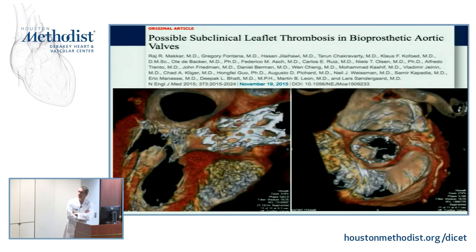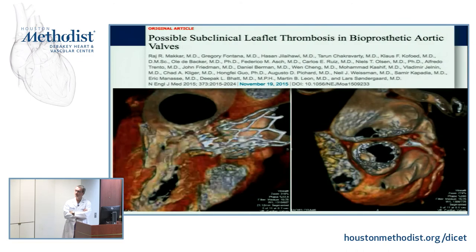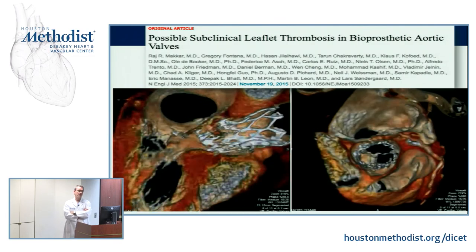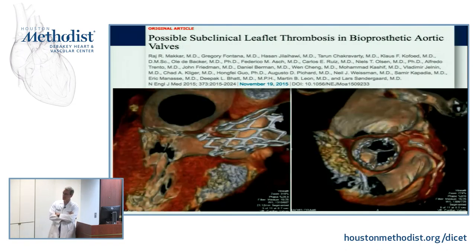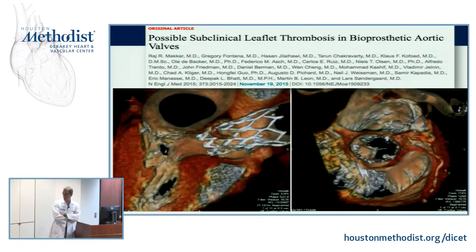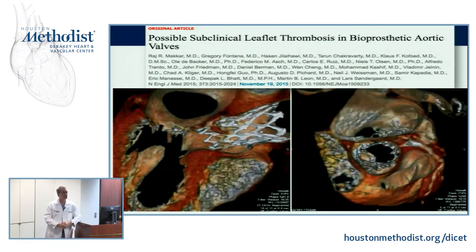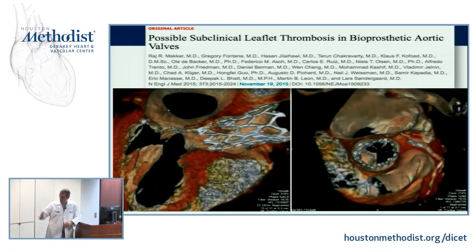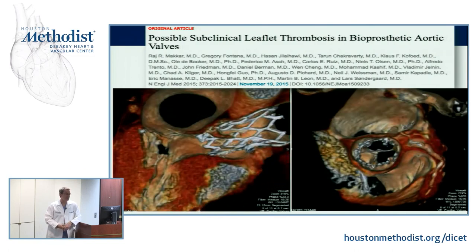This is probably the most exciting stuff for a lot of folks, and it's really changed a lot of the clinical approach to transcatheter valves, and increasingly bioprosthetic valves: this notion of subclinical leaflet thrombosis. If you do CT on a lot of people, which some of these TAVR trials are doing... It's interesting how the effect of this absolutely killed perhaps a company, certainly a valve, and maybe even a site. This was a nationally funded randomized clinical trial for one particular valve. The site said, we want to do a little sub-study of CT imaging within the larger trial. They did. They saw this finding, had to report it to the FDA, and the entire trial was shut down. For many months, stock prices plummeted.